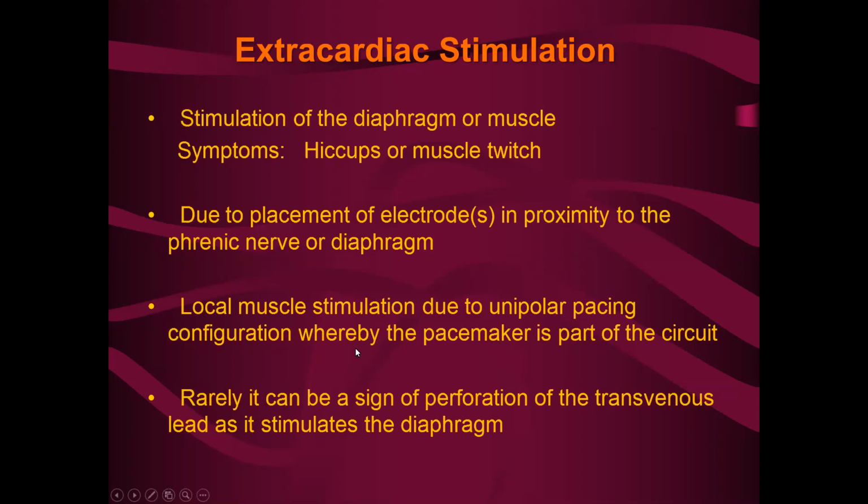So the way to get around that would be to reduce the energy output as much as we can without sacrificing the safety margin, to see if we can avoid capturing the pocket muscle tissue or the phrenic nerve or the diaphragmatic stim.